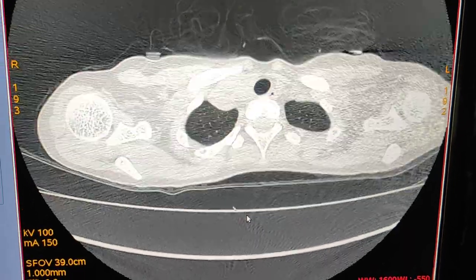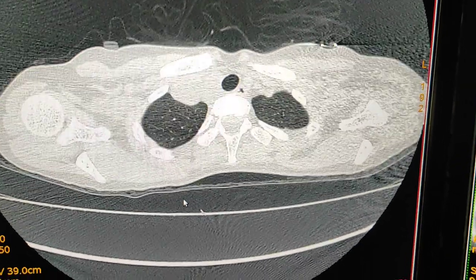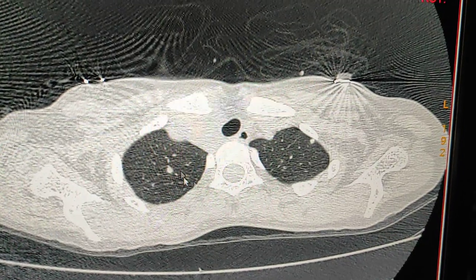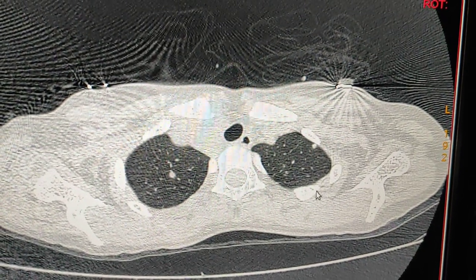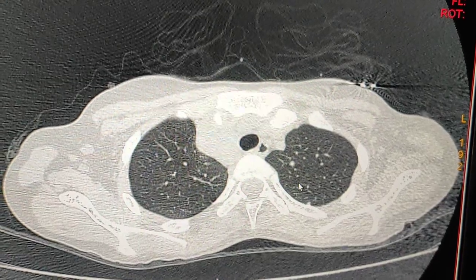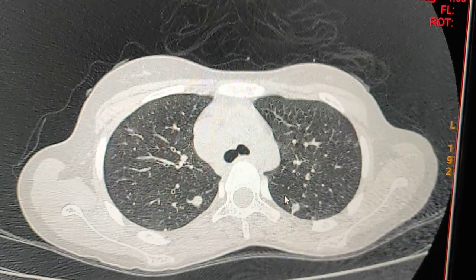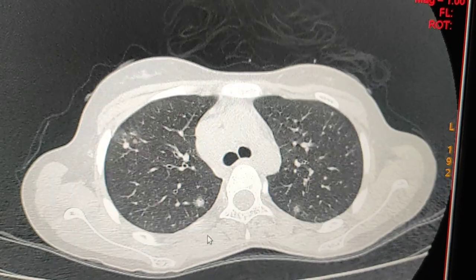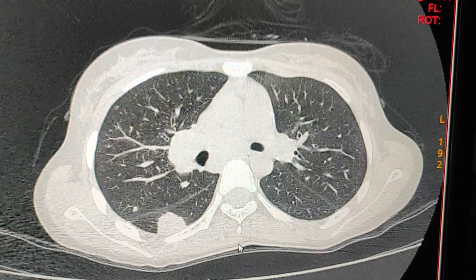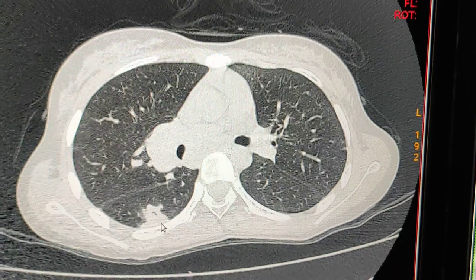I will show you from the lung apex. These are the small nodules in the upper lobe — you can see the small nodules. This is also a small nodule, and this is a cavitary lesion. This is also a cavitary lesion with an air bronchogram.